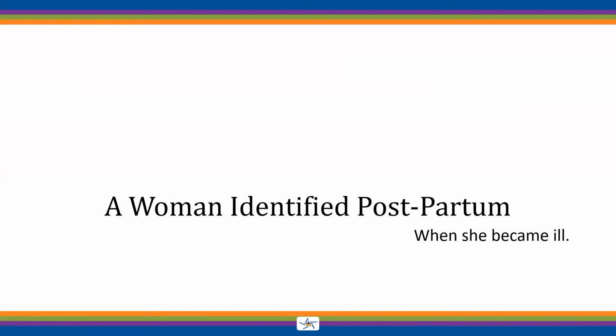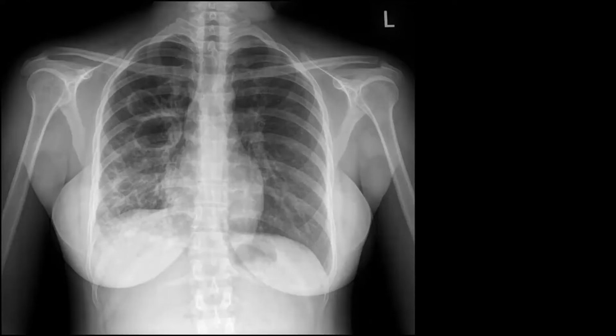And Dr. Armitage, this may be to your point, maybe her cough was worse, or maybe it was just that it was noticed more, as well as fever. And for those symptoms, she had a chest x-ray. Now this one is not subtle. So now who knows what it might have looked like 6 months prior. There certainly obviously would have been disease, but it may not have been as obvious.